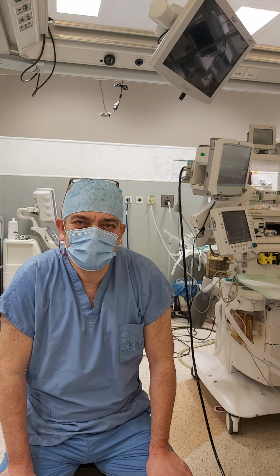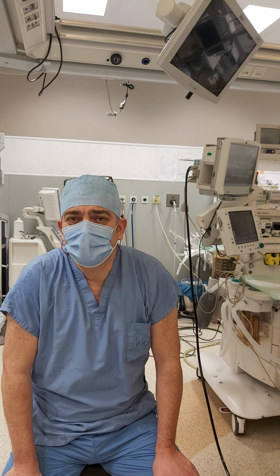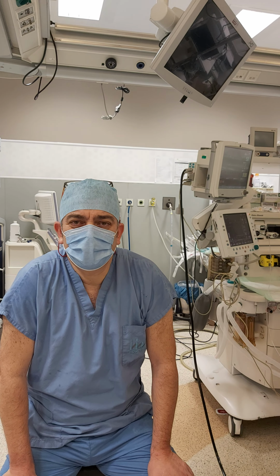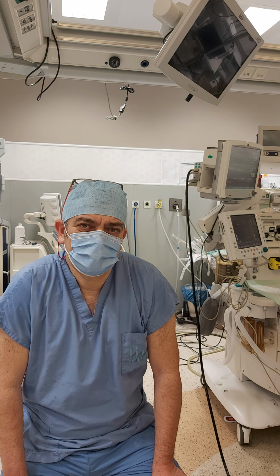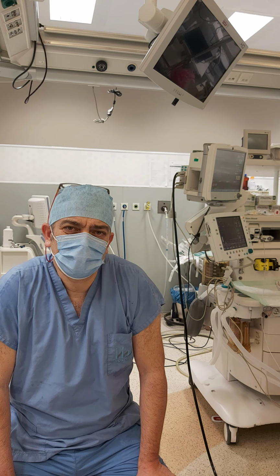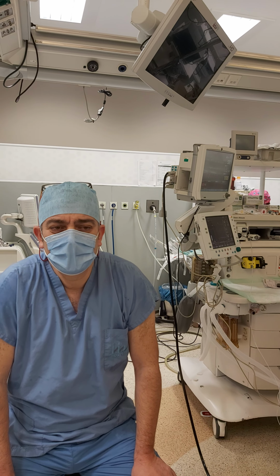There were untouched places. This was just a biopsy, a very deep biopsy, and this deep biopsy may increase the pain during the healing period, and we corrected as much as we can. So after the procedure, we expect a long recovery for all patients, like 3 months, maybe more than 3 months.